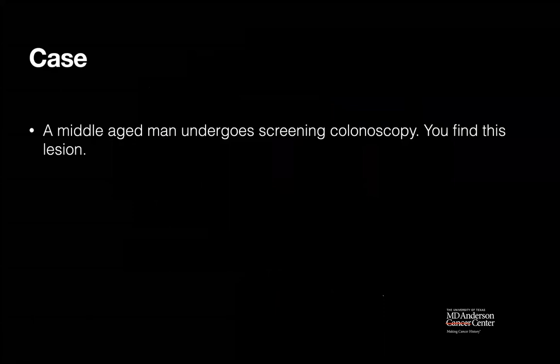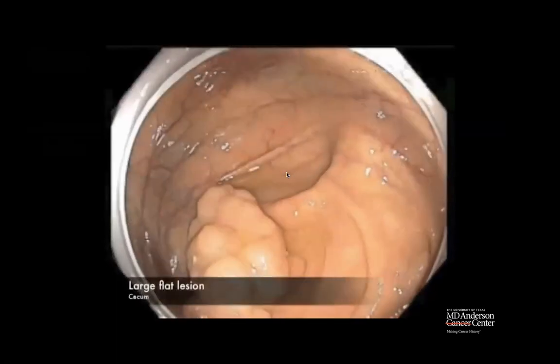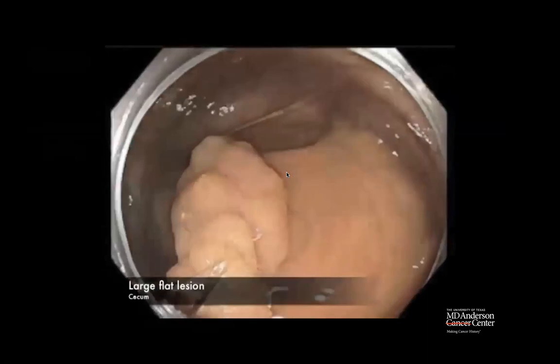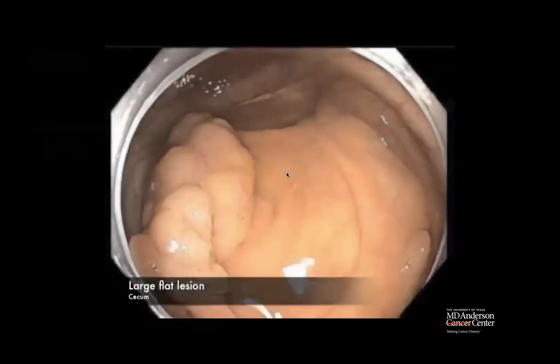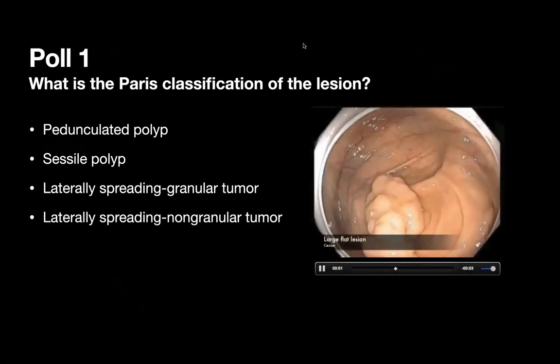So we're going to talk about this case that I saw a few years ago. This is a middle-aged man who came for colon cancer screening, and this is what you see. You can see the lesion there. So I'll request Selvi to run the poll, and let me run this video one more time.